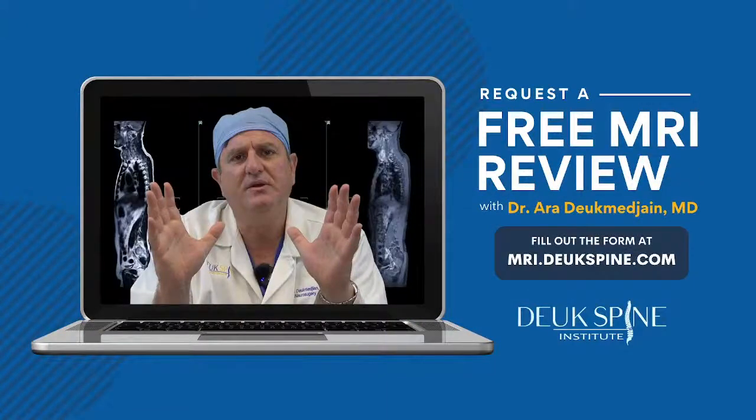I'm going to call our blood loss, she's not even a mil. It's like 2 drops.